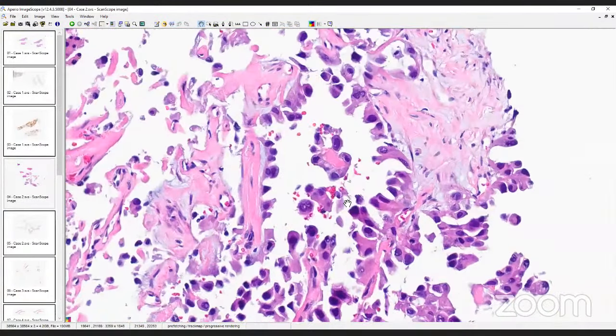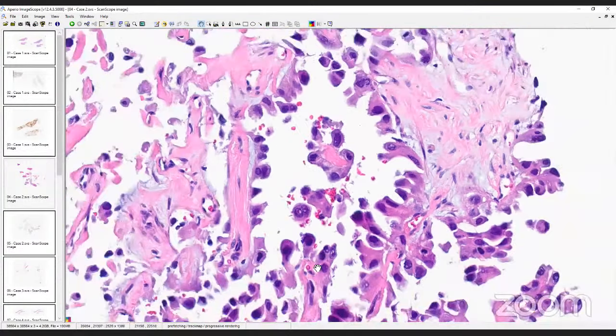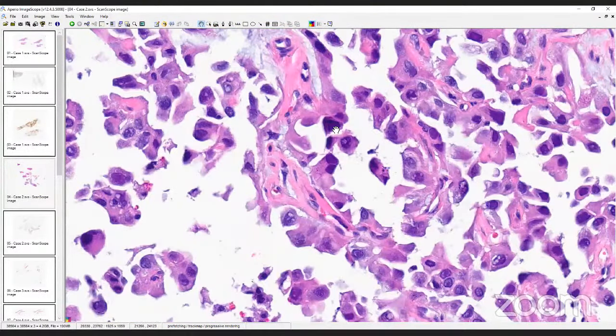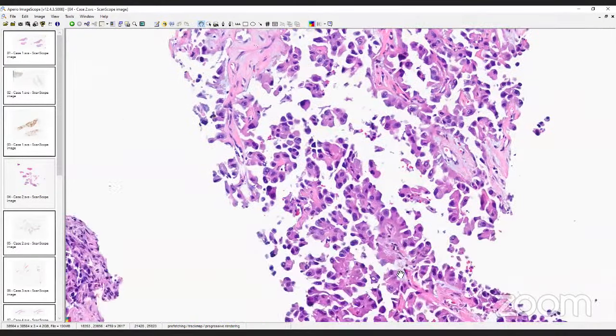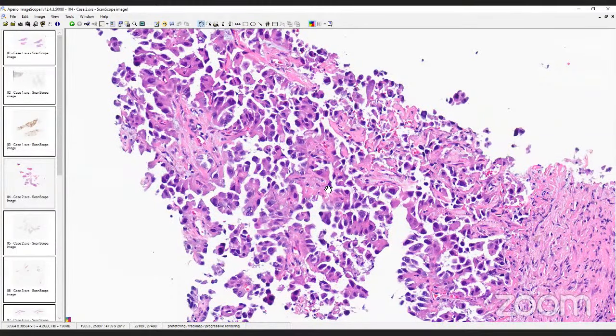And once we start looking at the cells, there is this sort of hobnailed appearance, with angry-looking, hyperchromatic nuclei, and some more of that. Again, the hobnailing, the hyperchromasia, the pleomorphism. In other words, it is an ugly tumor. And she was an 84-year-old woman. So some of the thoughts that came to our head were GYN tumors, for example, maybe a kidney tumor, a lung tumor. Those were our three main considerations when we looked at this case.